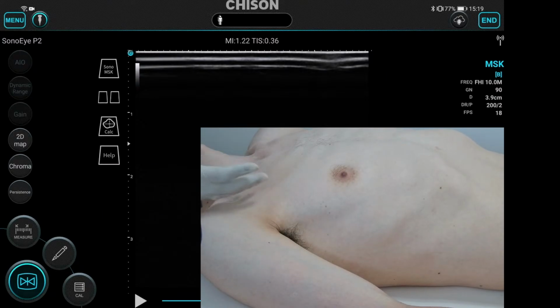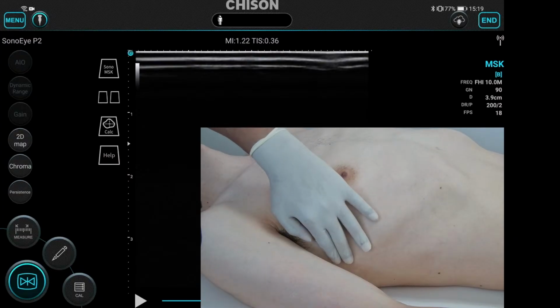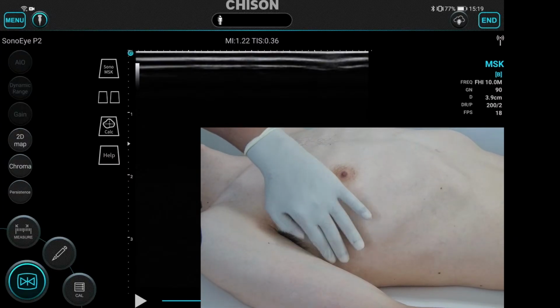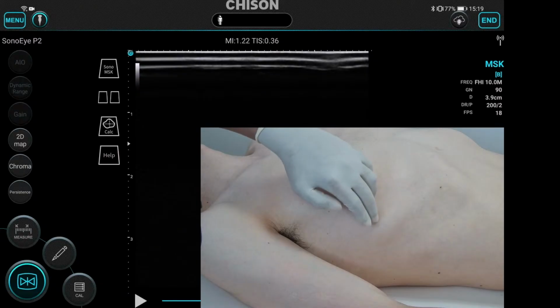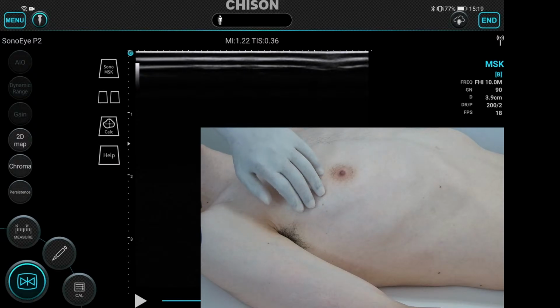Okay, this is a kind of a block which is used majorly for anterior and lateral chest wall surgeries like mastectomy. Next we have is the SAP block, which is focusing majorly on the lateral chest walls, targeting the lateral cutaneous branches of intercostal nerves from T2 to T9, and again with cutaneous branches, long thoracic nerves and thoracodorsal nerves, and basically used for any surgeries which involves rib fractures.